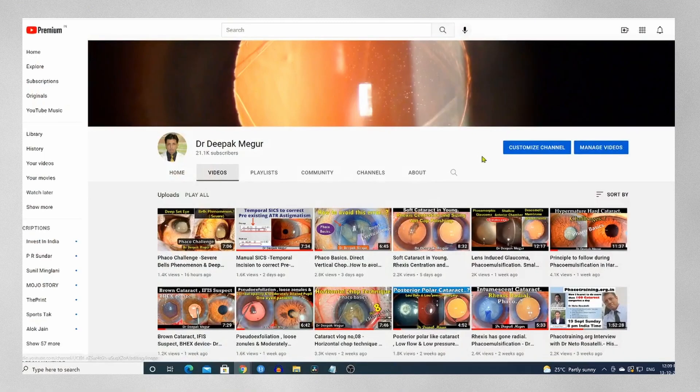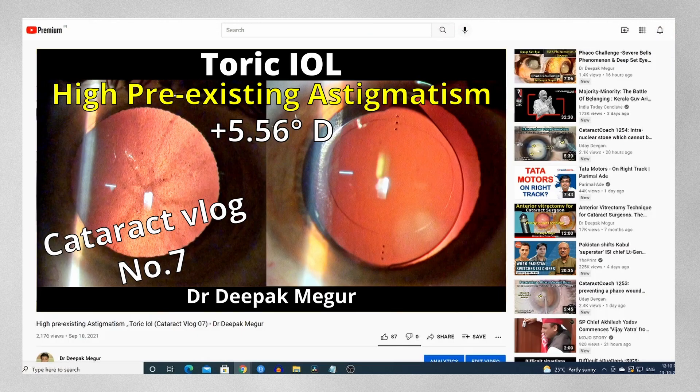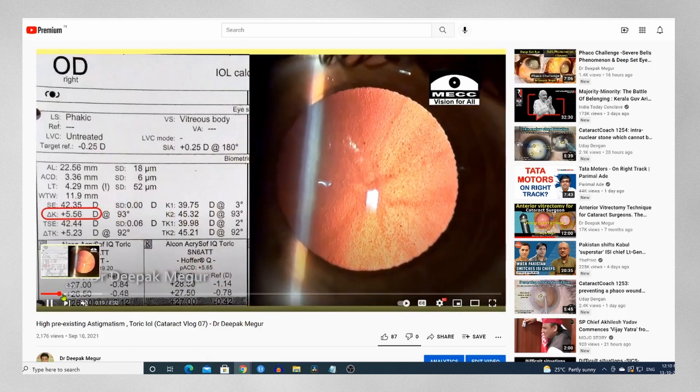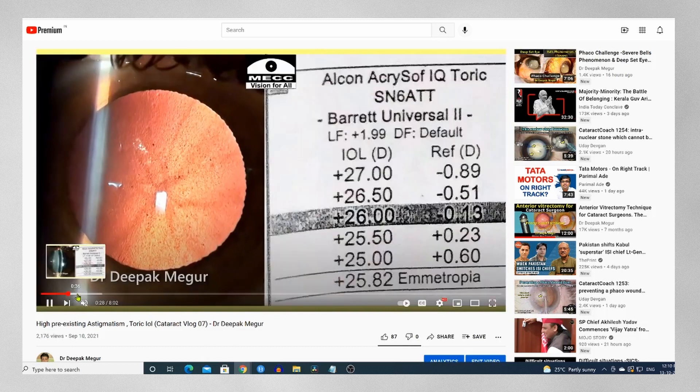The followers of this channel might remember that a couple of days back I had posted a video of his other eye undergoing surgery with a toric lens, where the astigmatism was about five and a half diopters of with-the-rule pre-existing cylinder.